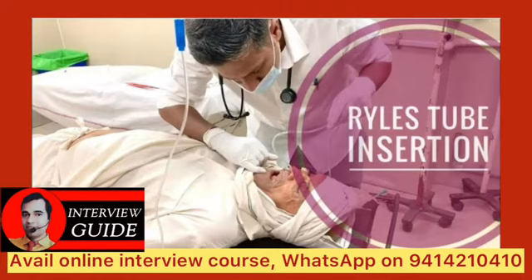The tip of the Ryles tube contains radiopaque material which produces radiopaque shadows, and the tip contains small openings through which the contents are either suctioned or given in the stomach or duodenum.